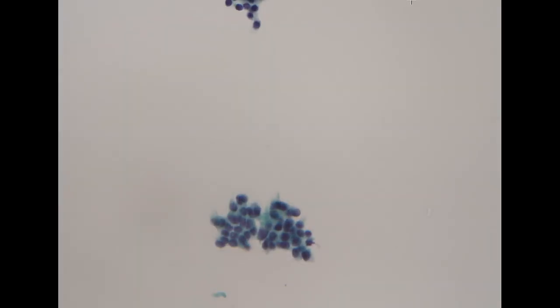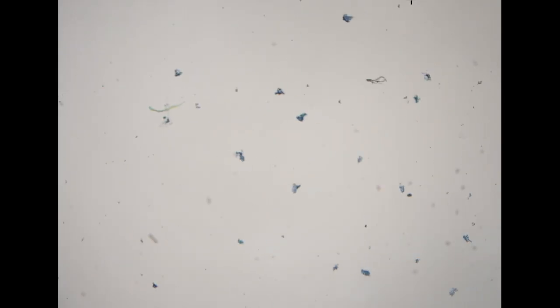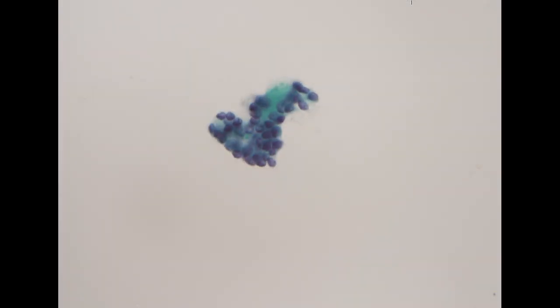So papillary thyroid carcinoma, it depends on the sampling. Sometimes you will get tons of cell on low power. It's already very clear that it is a PTC. Sometimes you only get very scant cells, so it can mimic a follicular tumor on low power. Sometimes the cells are just too scant. You might not be able to make a definite diagnosis. So you will use like a suspicious or AUS diagnosis like what we talked about last Friday.